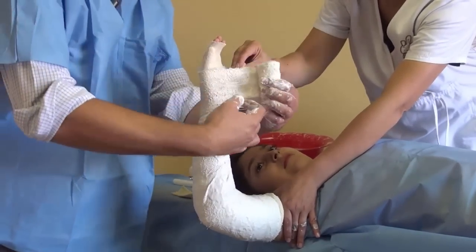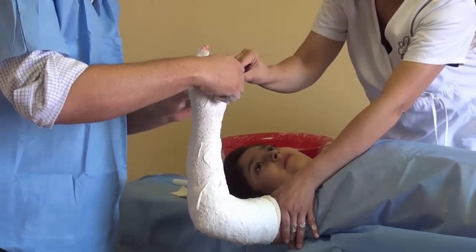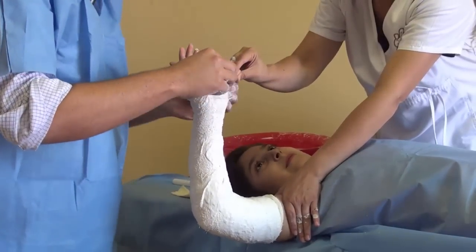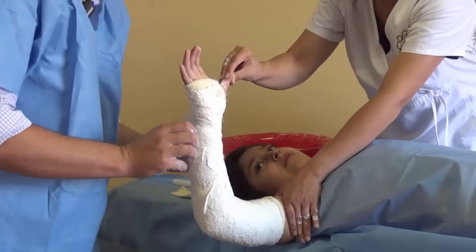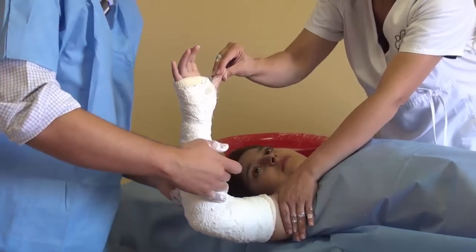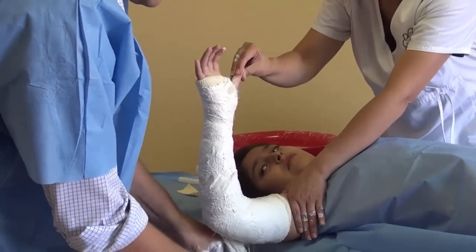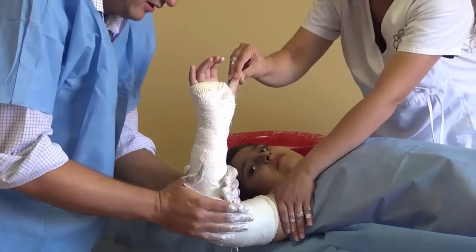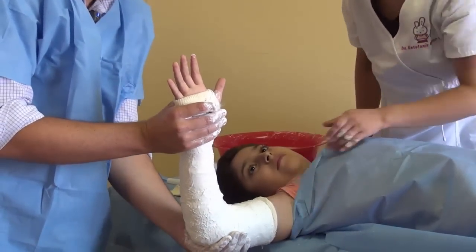Some people make a cut here to go through the thumb; some people just do this — no cuts. Make sure you go around the wrist almost two or three times, then back up to the elbow. We're going to cut it here. Make sure you take all the air out of the cast, make sure you get it in the right position, and then let it dry. And that's it.